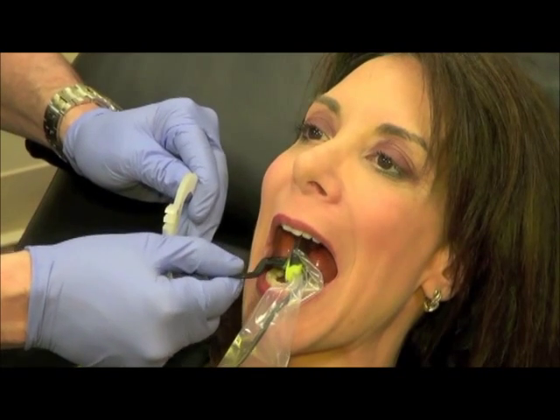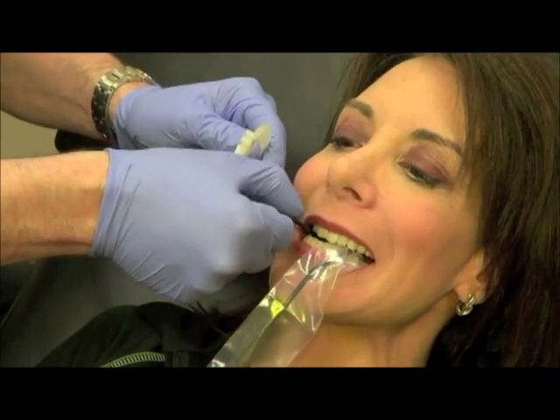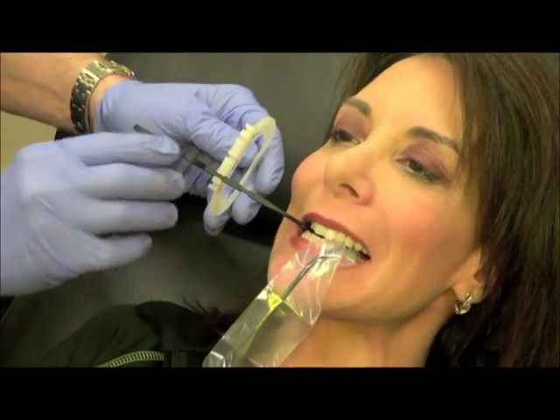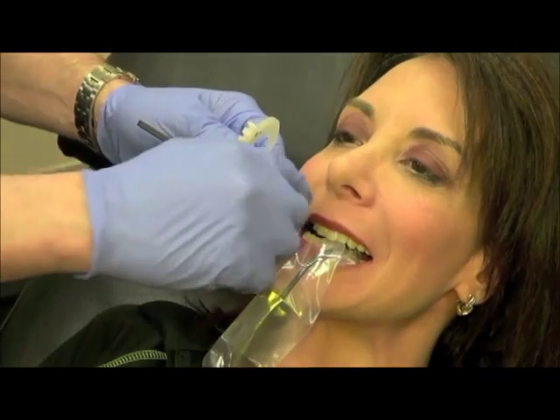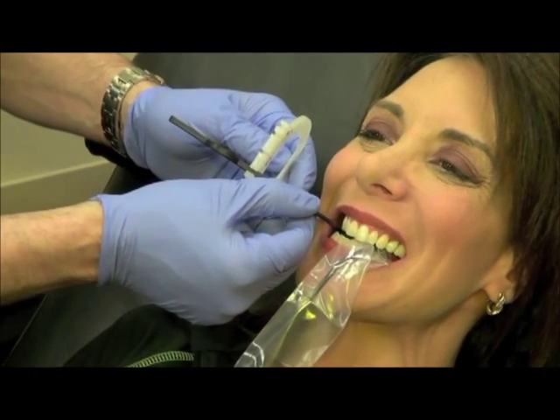Here I'm shifting the sensor to the other side of the mouth and we've got more of an angle coming forward. We're actually bisecting that premolar to canine contact with the lines.